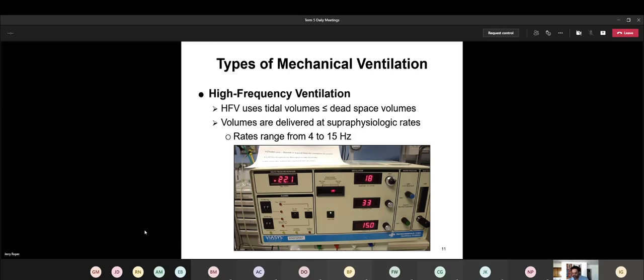All right, so here we have, again, not much going on. Here's your mean pressure monitor. And why they include a positive sign here, I'm not sure, because there's really no situation where your mean airway pressure is going to be -10. But maybe it's one of those things where it could be helpful for troubleshooting. And then this is 3 little LEDs.